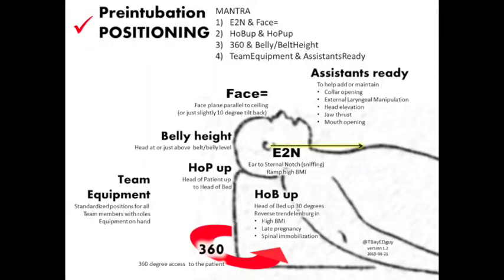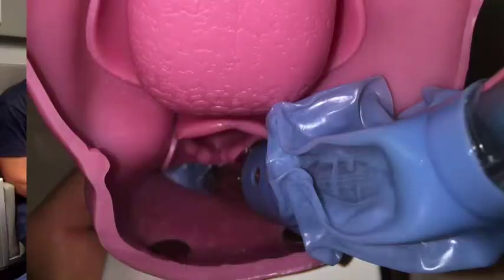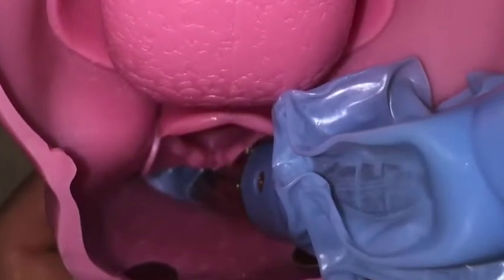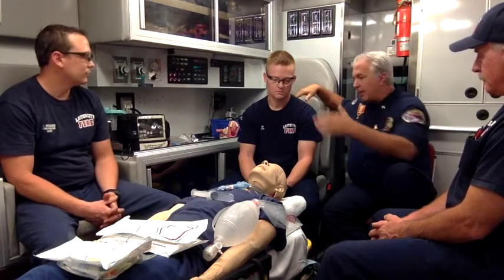Huge, right? And I will tell you it's even more important with the supraglottic airway, because is a supraglottic airway a definitive airway? Is it the gold standard airway? No, it's not, right? Because we could still get regurgitation, we could still get reflux, and we could still get an aspiration with supraglottic as opposed to intubation, because we don't have that cuffed ET tube through the cords. So one of the ways that we can avoid that is just exactly what Bud was talking about.